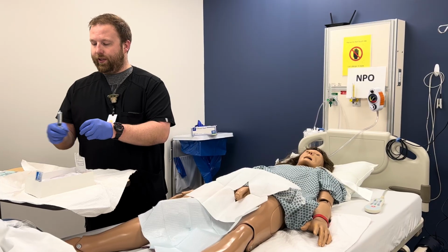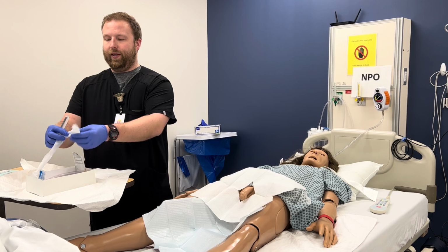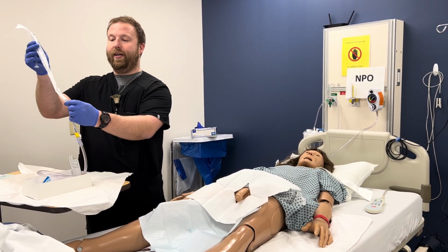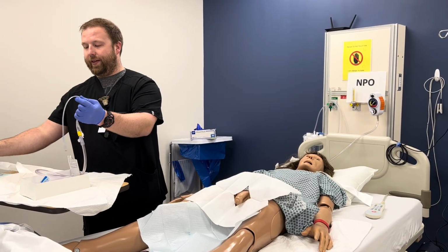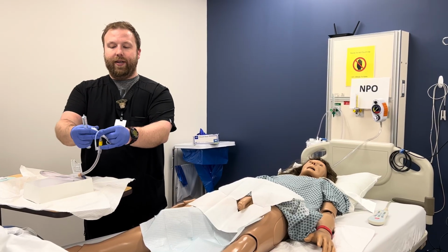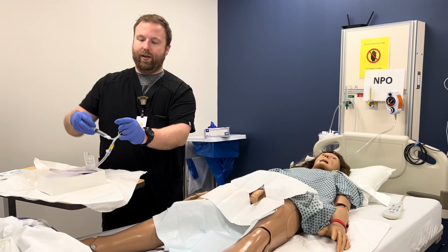The syringe is going to be attached to your Foley. You'll have it in a sheath like this. You want to be careful as you're taking it out. Some people will let it fall down. Just make sure that it doesn't hit your arm or any other surfaces. You'll connect the syringe here to this little port.